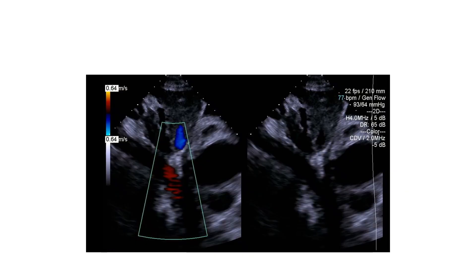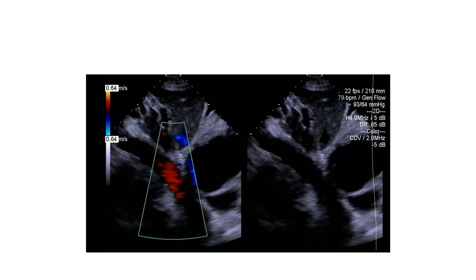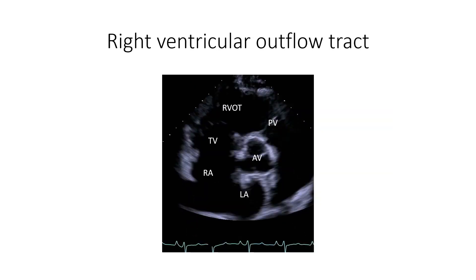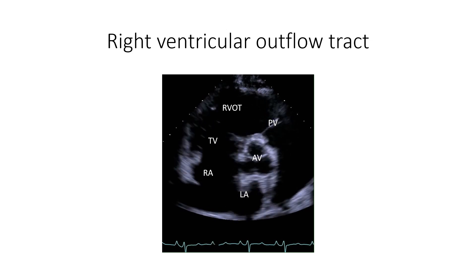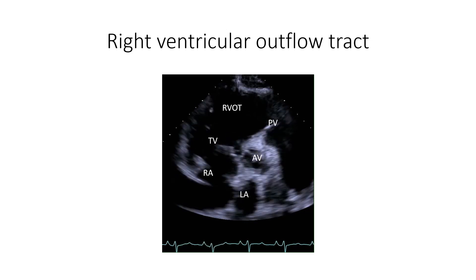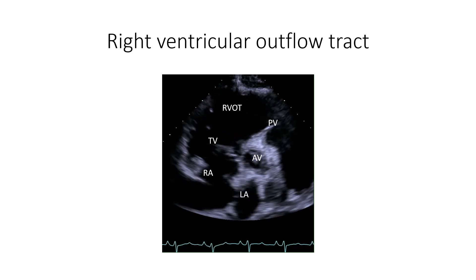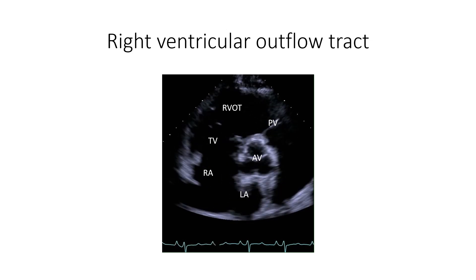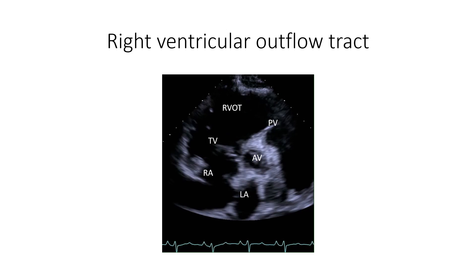Here we show how the inferior vena cava diameter is measured at rest and during inspiration to provide an estimate of the right atrial pressure. In the right ventricular outflow tract view in the long axis, we can see the aortic valve and the pulmonary artery. The right ventricular outflow tract is used to assess the main pulmonary artery, which can be dilated in pulmonary hypertension in relation to the adjacent aorta. The pulmonary valve apparatus can also be visualized here.